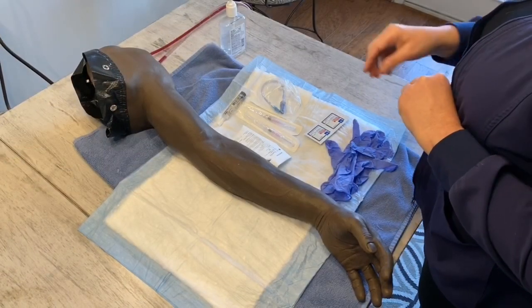It's Professor Kristen, and I'm here today to show you a step-by-step insertion of a peripheral IV. So let's get started. Now let's set up our supplies.